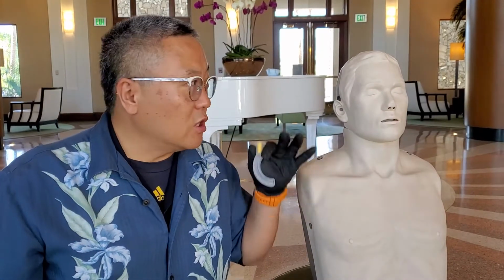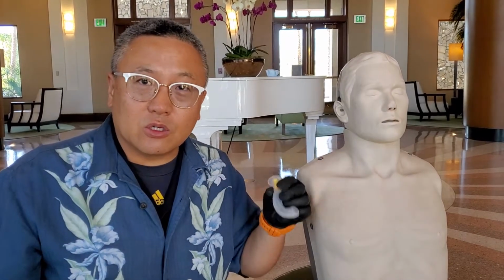So my name is Shin De Kong, and today I'll go over OPA and NPA. OPA stands for oropharyngeal airway, and NPA stands for nasopharyngeal airway. Okay, so please remember how to measure, what's a contraindication, and the indication of the OPA.